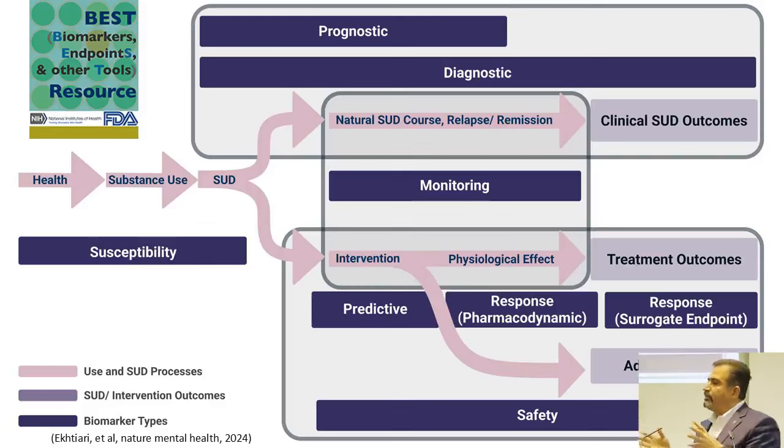Is there any chance that before starting these medications, based on the fMRI, we say, okay, because this patient has activation in ventral striatum, this patient is going to respond better to naltrexone, not acamprosate, not disulfiram, so we need to focus on naltrexone and just optimize the dose of naltrexone? Is there any chance that we can use that in deciding which treatment is going to be more helpful? That could be another way of doing that.